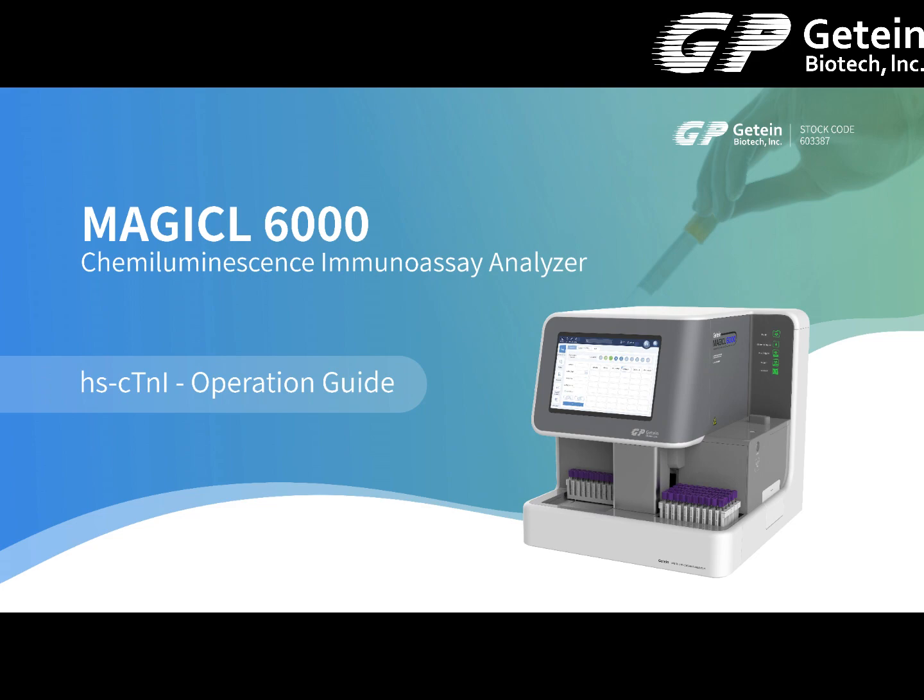Magical 6000 chemiluminescence immunoassay analyzer — high-sensitive cardiac troponin I operation guide.